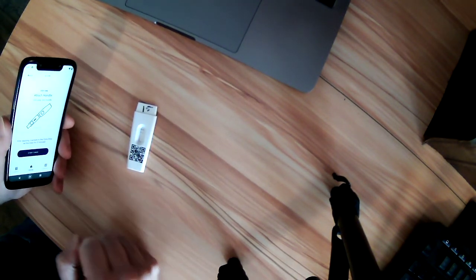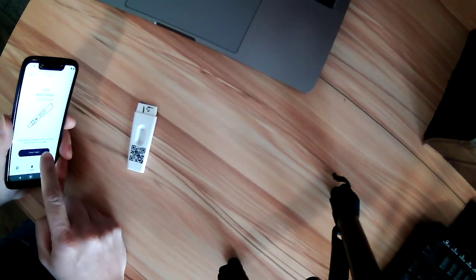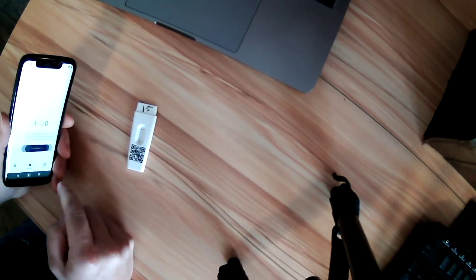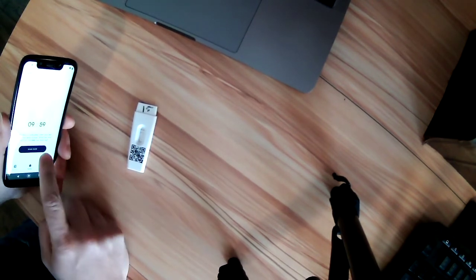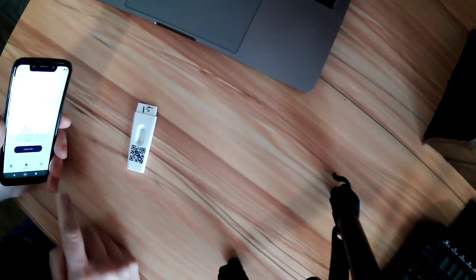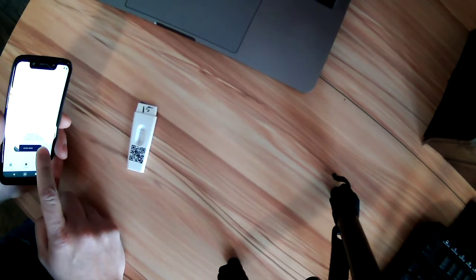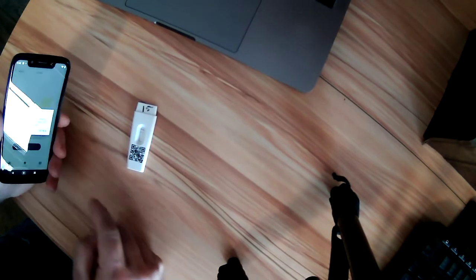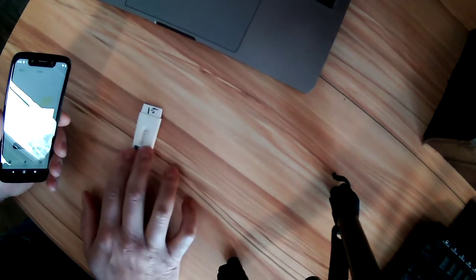The first screen is just telling you to apply your urine sample and then start your timer. We already have a test strip here.